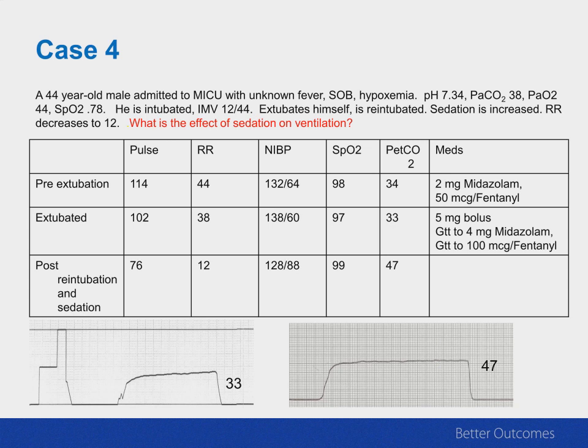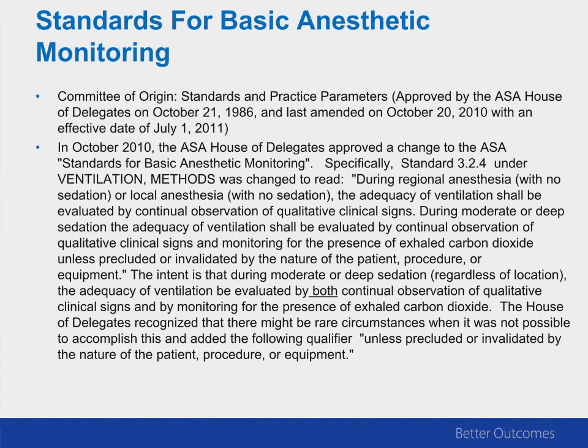Well, notice that the end tidal went from 33 to 47. But if you take a look at the other parameters, you might not be worried about that. So, for example, his heart rate came down, his respiratory rate came down. Well, that was because of the sedation. And so the problem with this is the end tidal level climbs alarmingly high. This patient really needs to have the ventilator support increased. What I want to go through on this is that the end tidal is what's warning you that something's wrong.